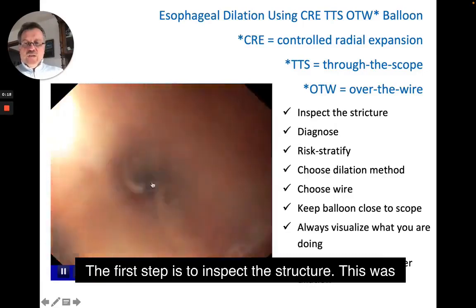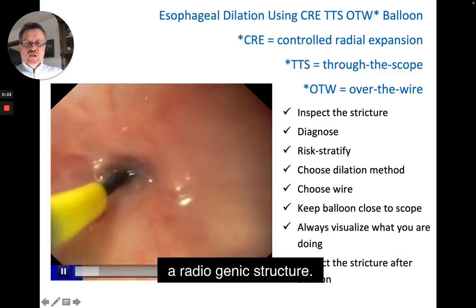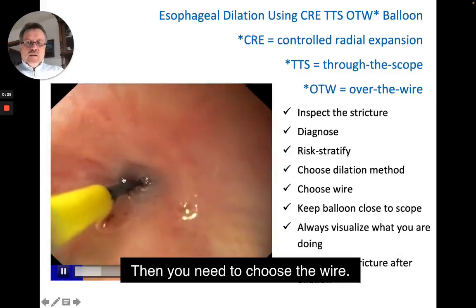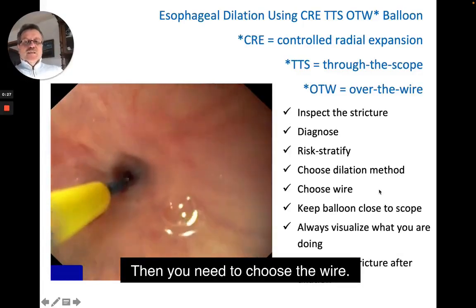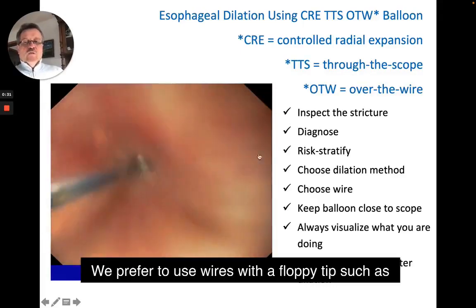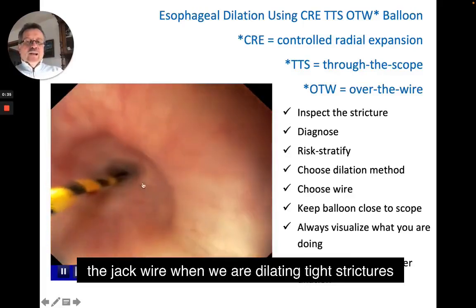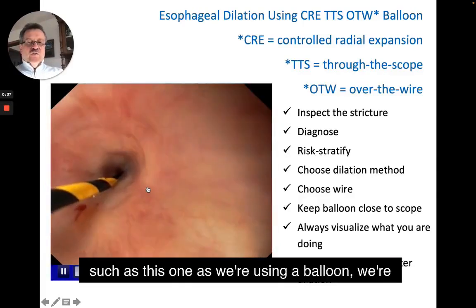The first step is to inspect the stricture. This was a radiogenic stricture. Then you need to choose the wire. We prefer to use wires with a floppy tip, such as the jack wire, when we are dilating tight strictures such as this one.